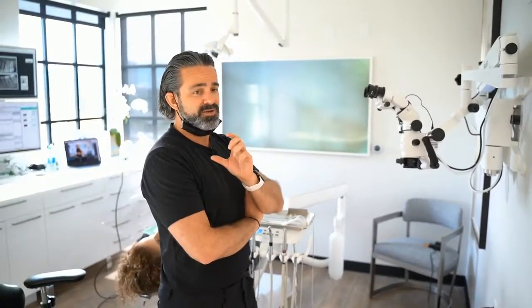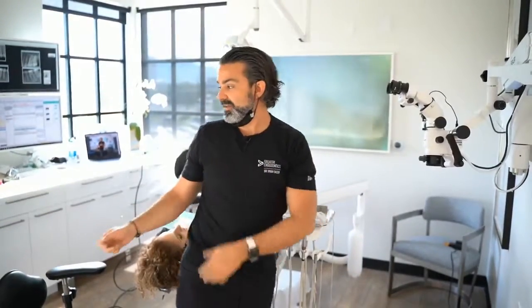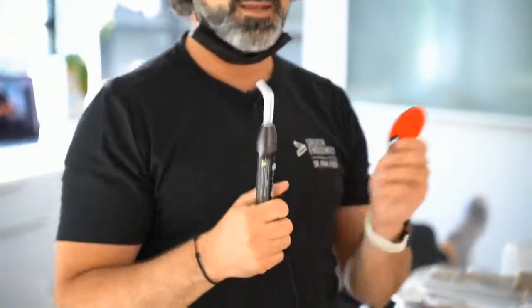But when it comes to actually seeing and doing the dentistry, not having the filters put in front of your face, being able to control it on your microscope, and the ability to articulate that puppy any way you want in any direction is great.